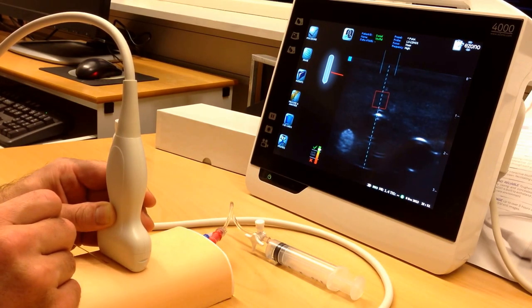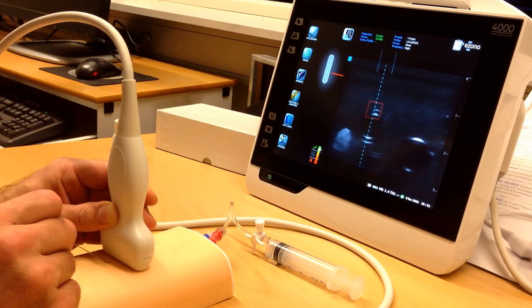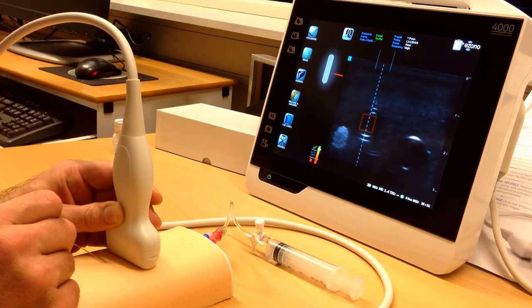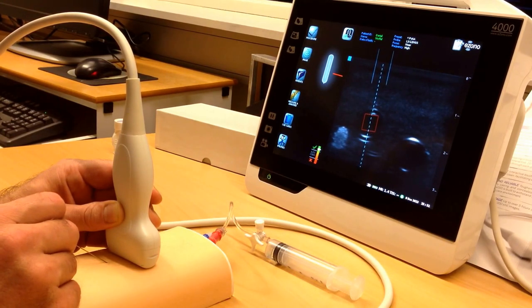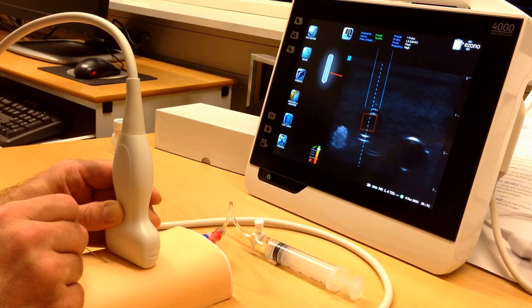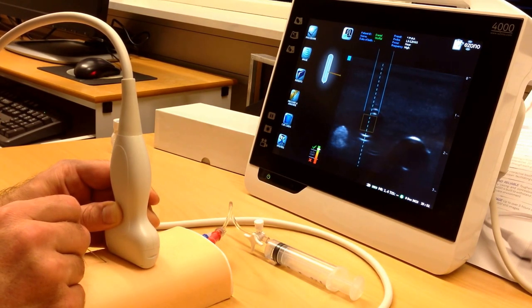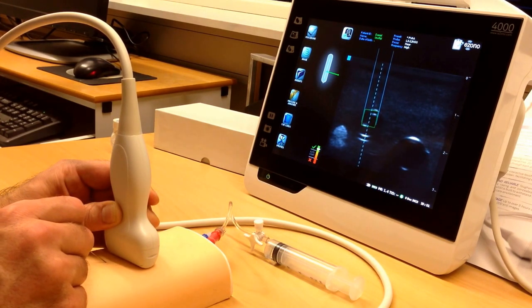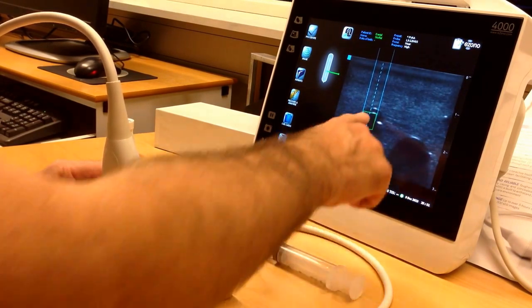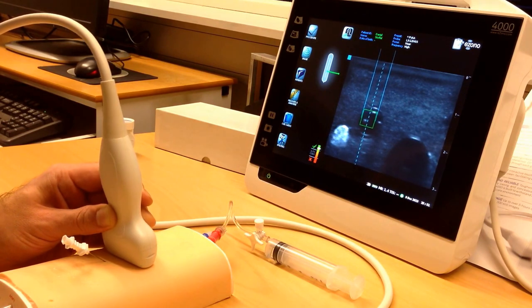I'm going to place it through my target and then go north with my probe, making sure that the red field is now in the vein. What I'm going to do now is keep the vein in focus and the red field in the vein, and push the needle in until the red field turns green. Now I can feel that I went through the vessel wall and I'm in the vessel — this is also indicated by the green field right here on the other side of the vessel wall. Here we go.